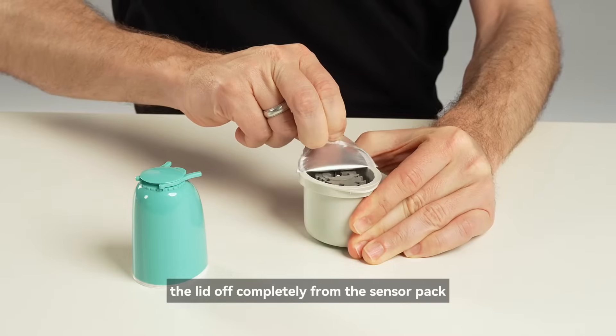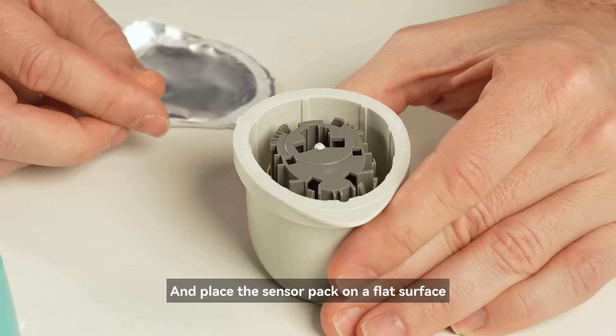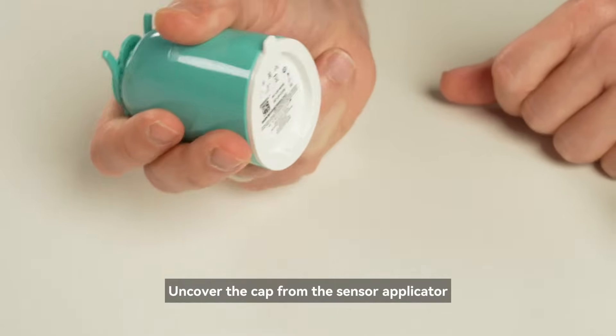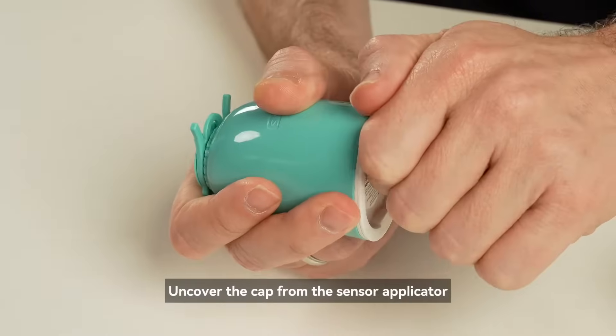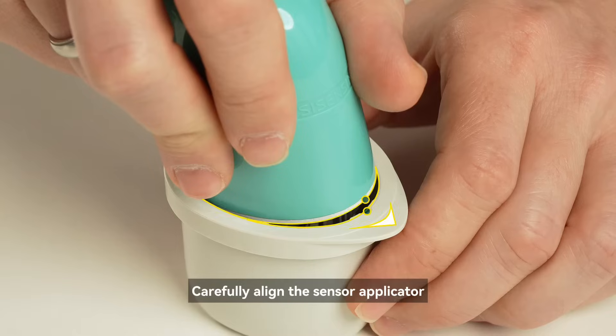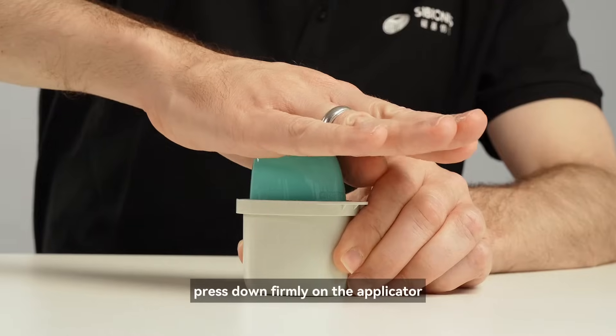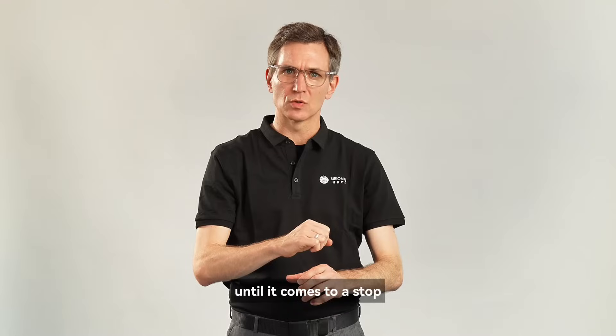Peel the lid off completely from the sensor pack and place the sensor pack on a flat surface. Uncover the cap from the sensor applicator. Carefully align the sensor applicator with the sensor pack. On a hard surface, press down firmly on the applicator until it comes to a stop.